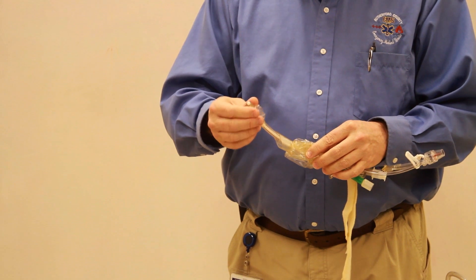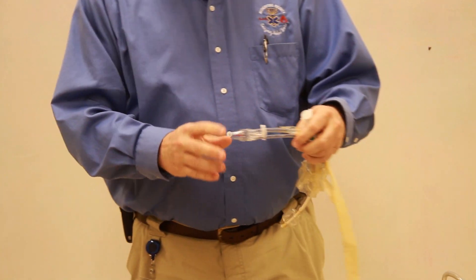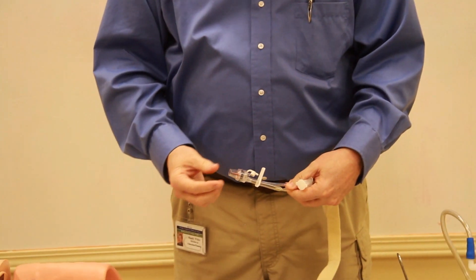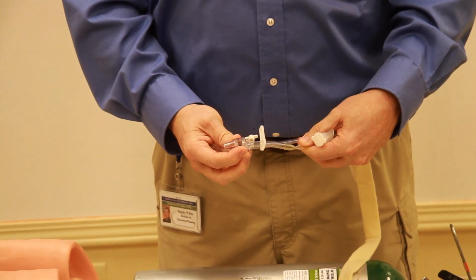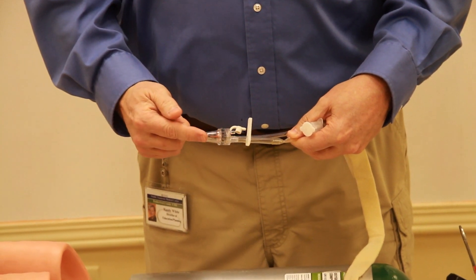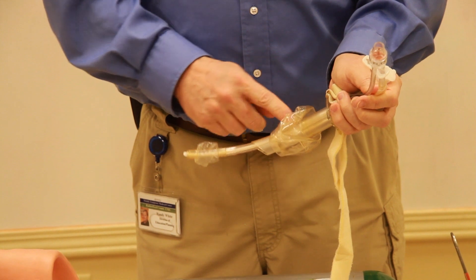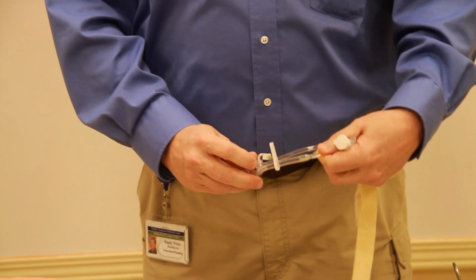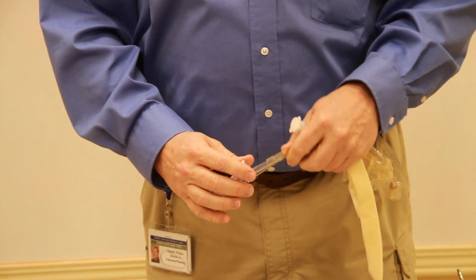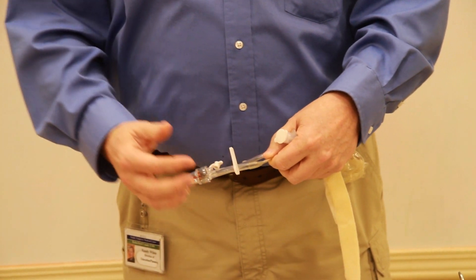This portion of the airway is where we inflate both the proximal balloon and the distal balloon. We'll need to close this port when we get ready to do that.